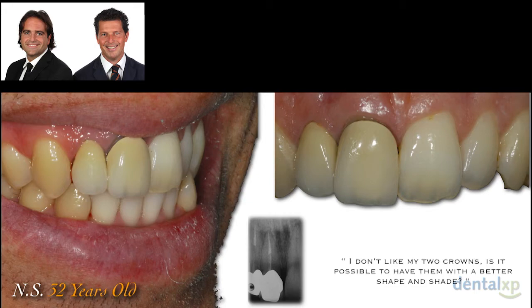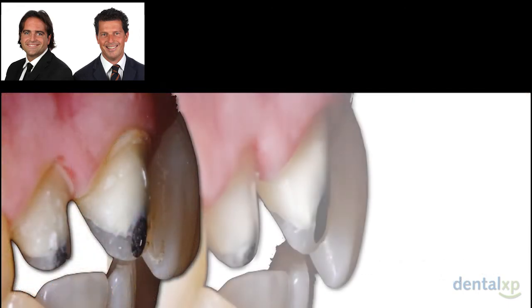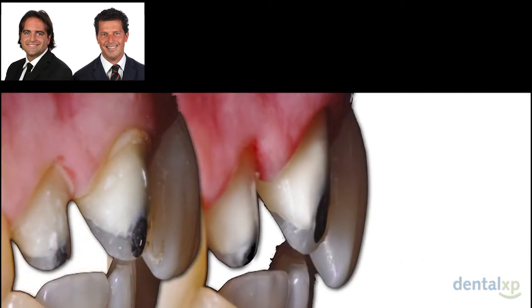So once we collected all the information, we started our treatment plan, and we wanted to be precise in every single step. And once we removed the crown, it was clear why these 2 restorations were too bulky. The technician didn't have enough space in order to build a proper final restoration.